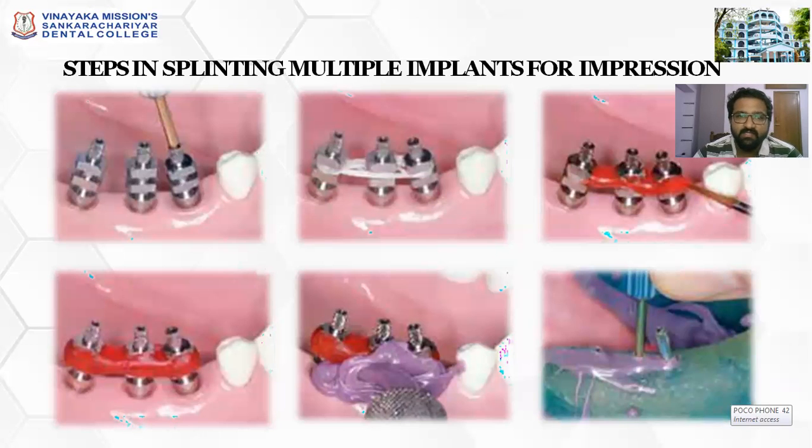Now coming on to the steps for splinting multiple implants. You are going to remove the healing abutment and place the transfer coping. With the help of a floss, you are going to tie the open tray transfer copings, and then with a figure of 8 motion, you are going to attach the floss onto the transfer copings, and then slowly apply pattern resin on top of the floss and let it set. Then you are going to inject the impression material surrounding the implant and use an open tray, the custom tray. You are going to fabricate a custom tray, and you have to create holes so that the screw vents are visible through the impression tray.